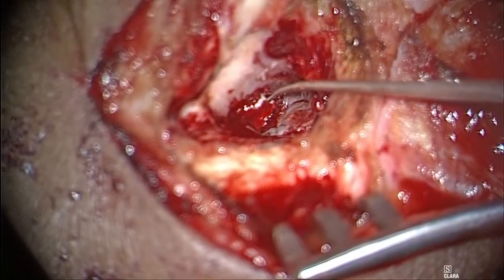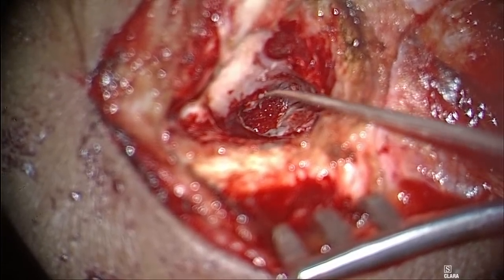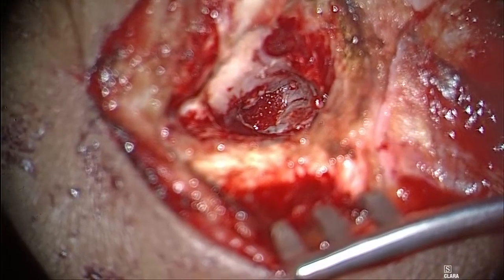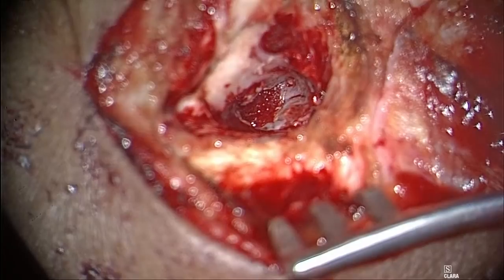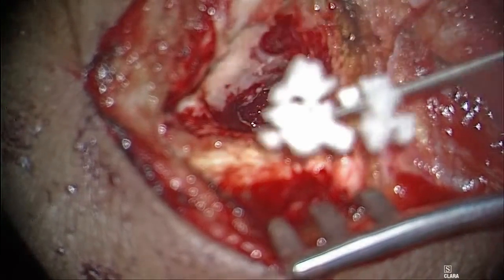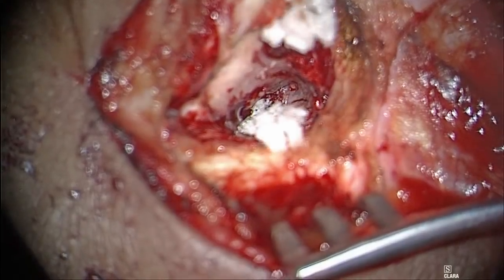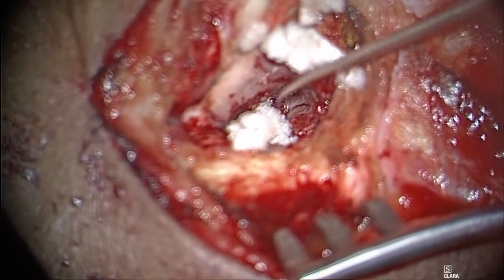Yes, Dr. Javed, I can split it to accommodate. Yes, that is also there. That's another technique. I also do the fish out technique. So yes, you're right, we can do what's called the fish out technique also. That is, make a small hole and then pull the handle of the malleus. That is there. So what about interlay grafting?